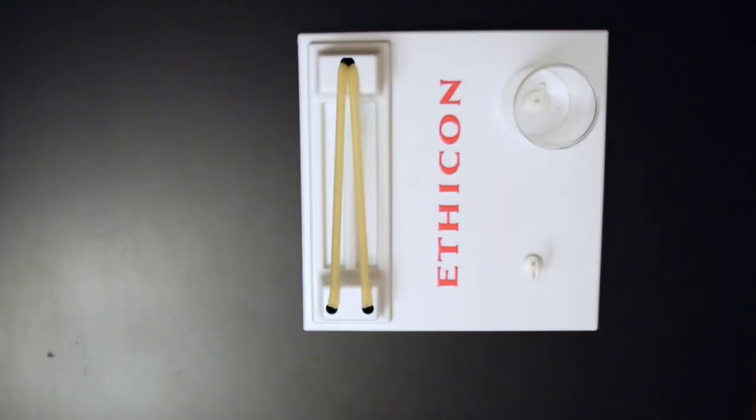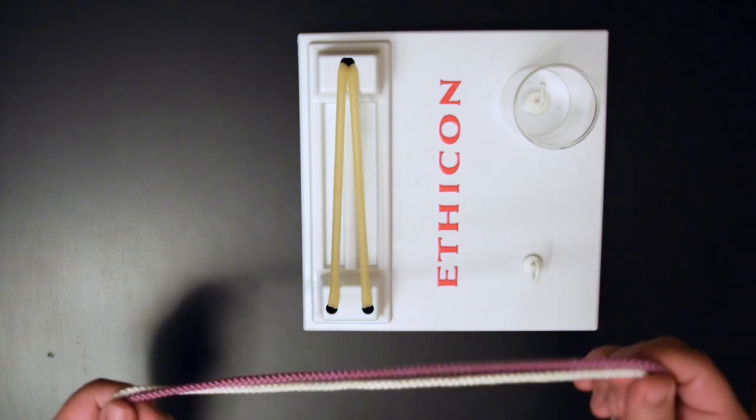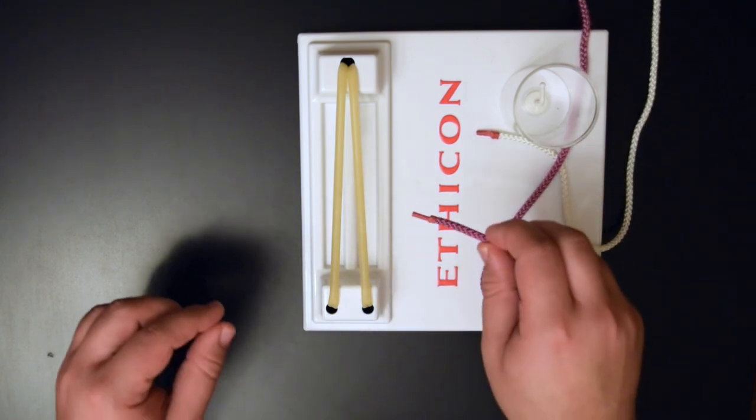In this video we're going to go through how to do a one-handed knot. As always you'll need something to tie to and something to tie with. I'll be using this two-tone rope, and we're going to assume that the needle is on our purple end of this rope.